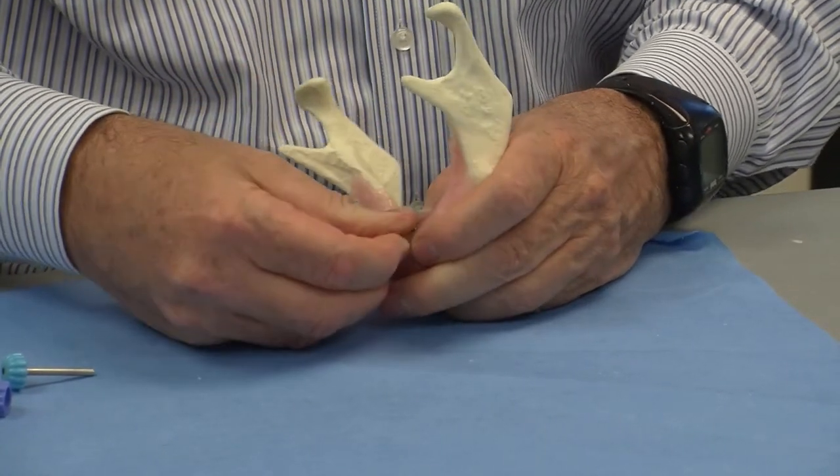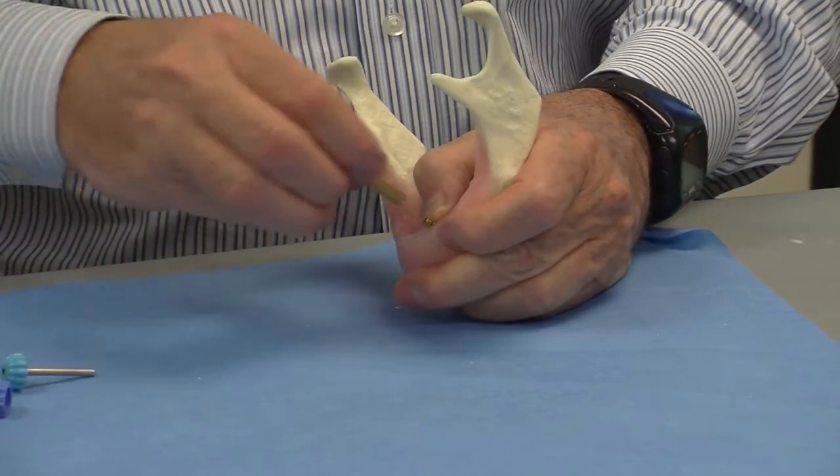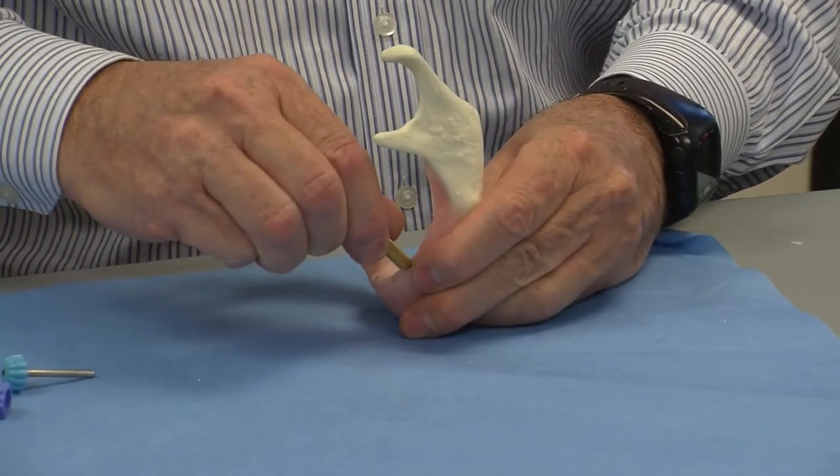Now the gingiva is much easier to deal with.